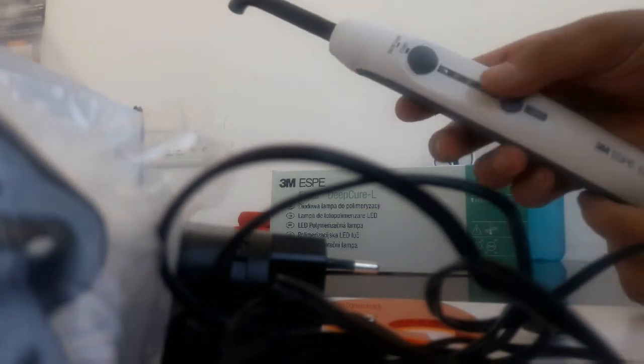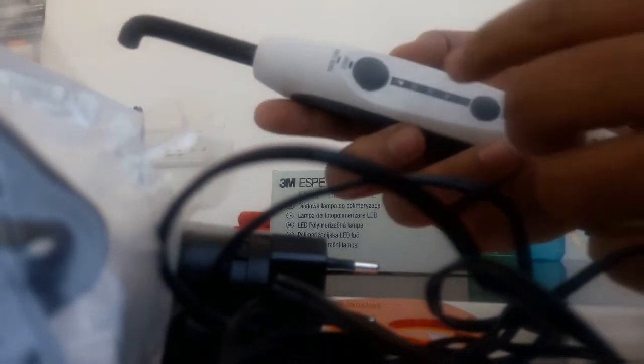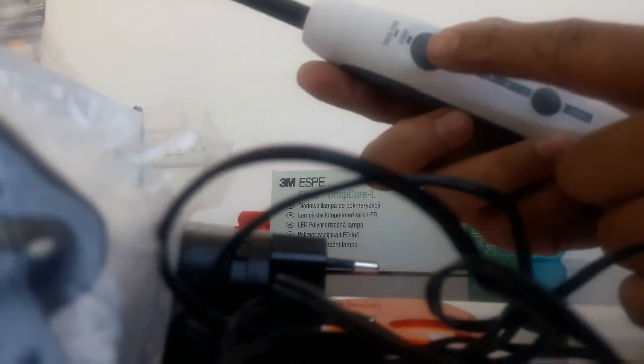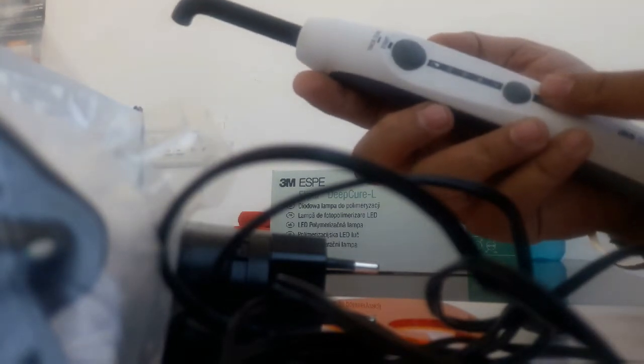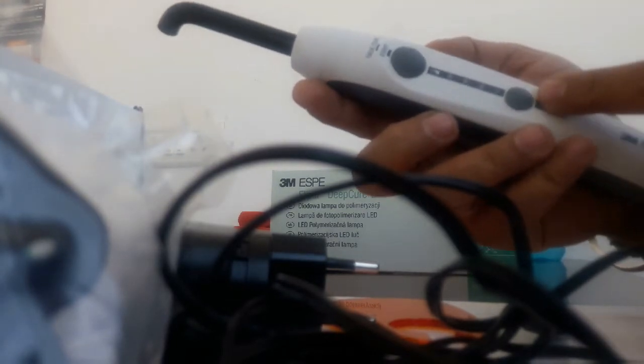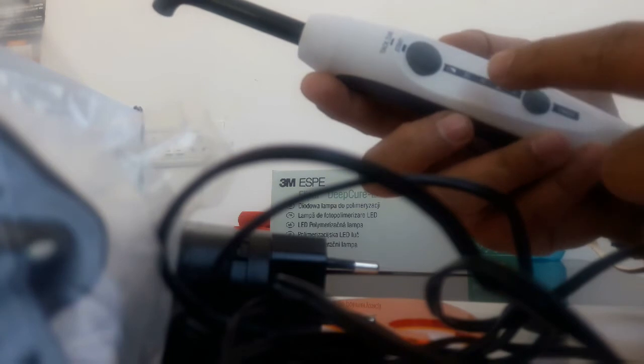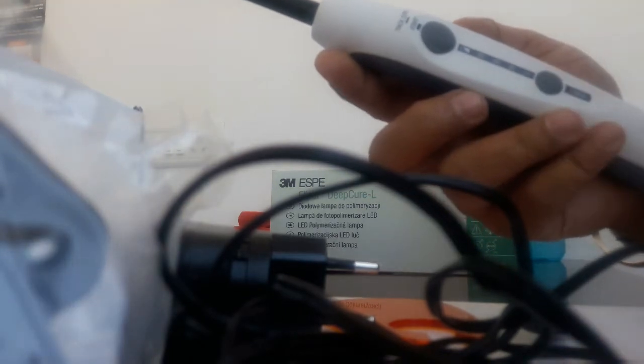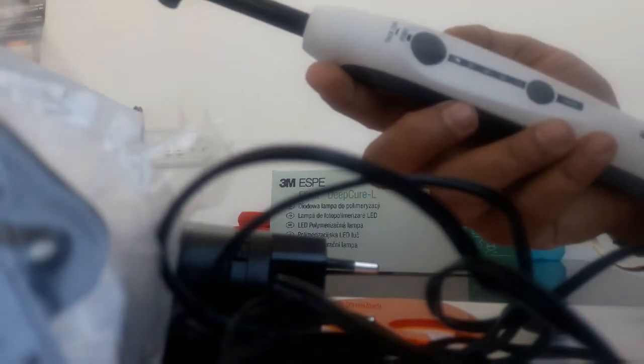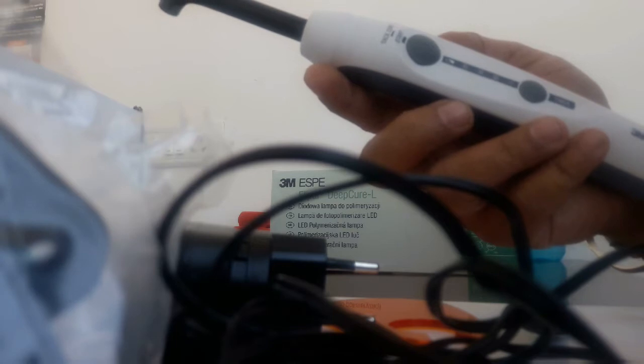It fits like this, and there is a button for start and also for the timer. The timer settings are 20 seconds, 15 seconds, 10 seconds, and 5 seconds, but the company says it cures in 5 seconds.